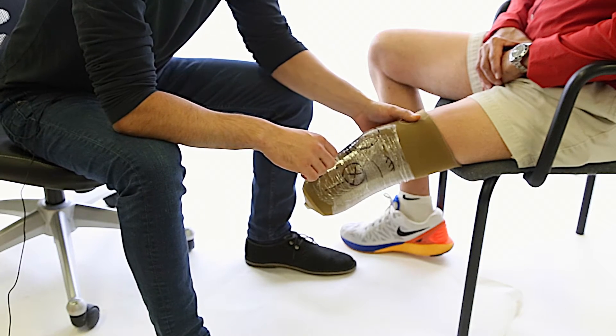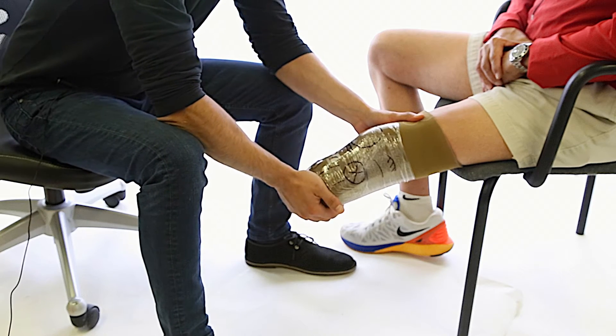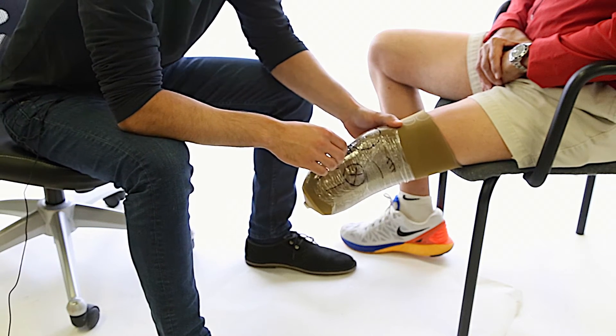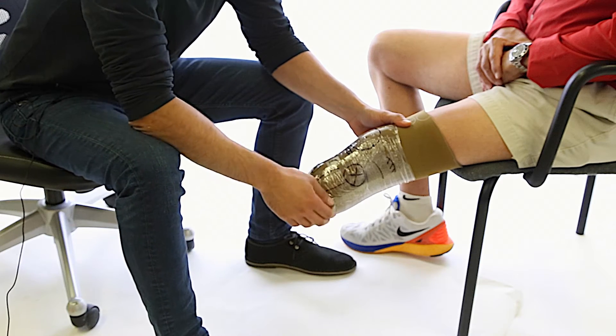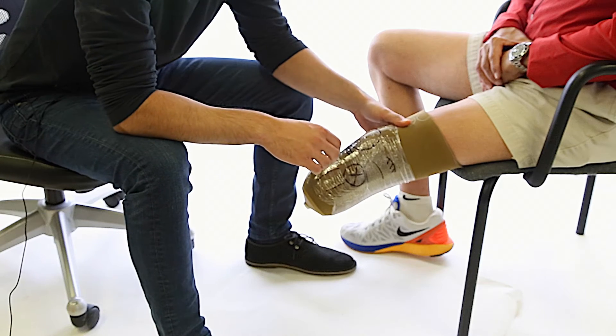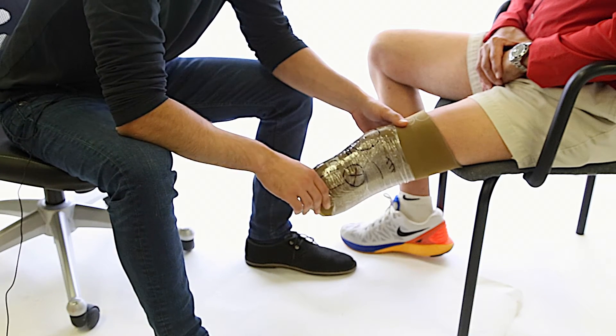As you can see here, the patient is in an appropriately sized liner. When the liner is on, we can check for tissue density. If the tissue is soft and the muscles are atrophied, then that tissue density is soft. If the tissue is regular muscle density, that is medium. And if the patient is extremely bony or has very firm musculature, then that falls under firm.